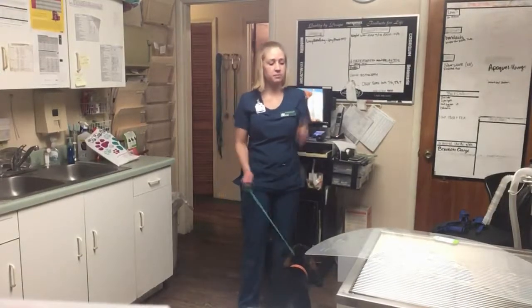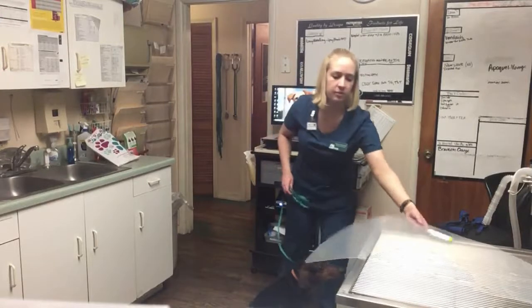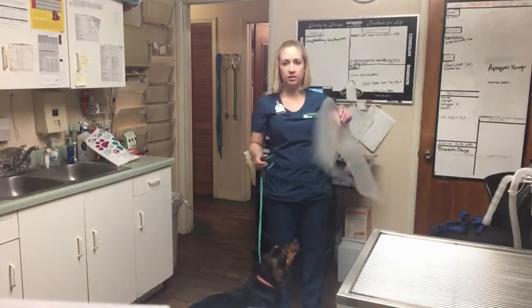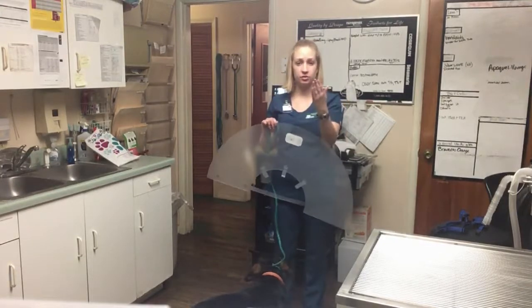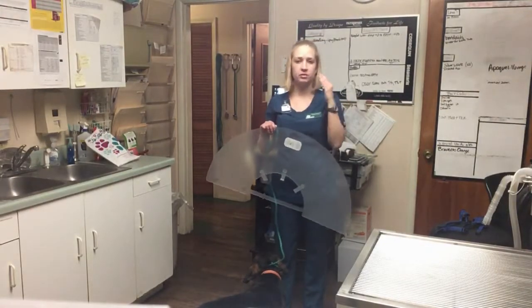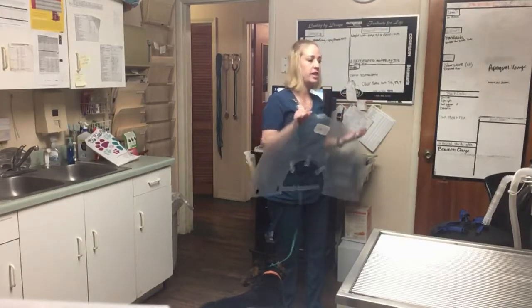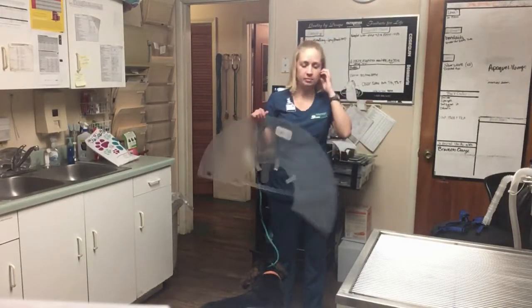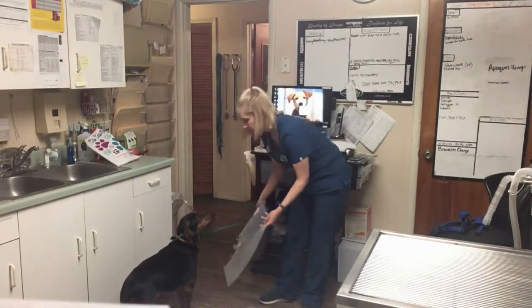Alright, so when you're fitting an Elizabethan collar for a patient, the two things you want to make sure of are that it's going to fit around their neck, and that this part is going to be past their nose, so that they can't get their nose past the e-collar and make it pointless for them to wear it at all. So I'm going to go ahead and be testing this with Rudy.